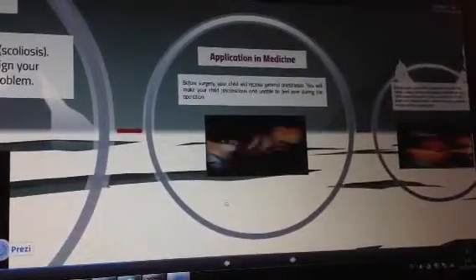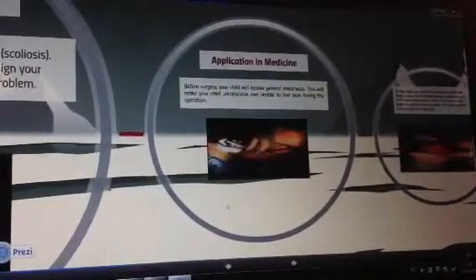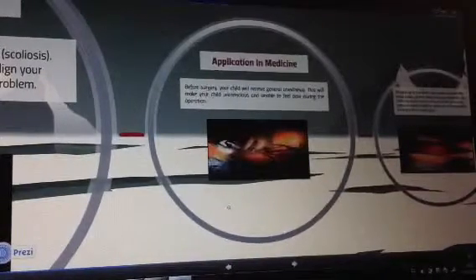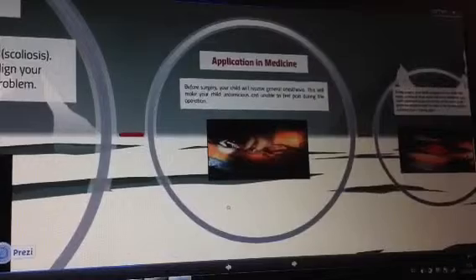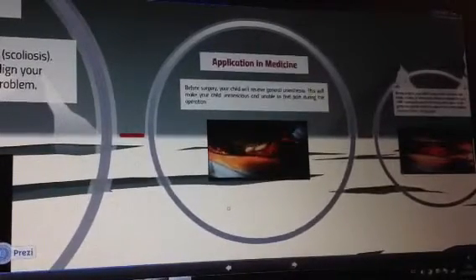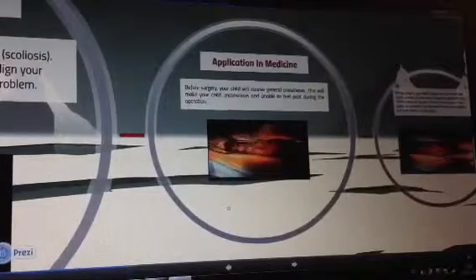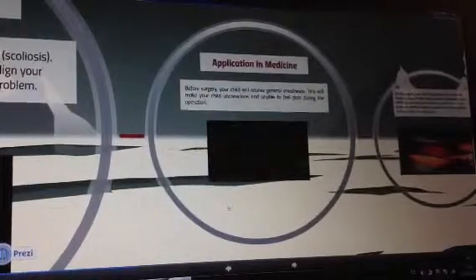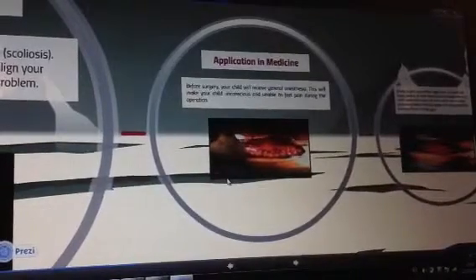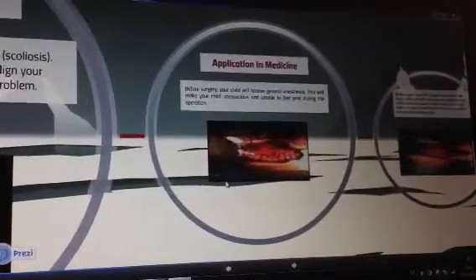Addressing the thoracic curvature, a subperiosteal dissection of the spine is performed, exposing the transverse processes, the facet joints, and the midline ligamentous structures. The interspinous ligaments are removed with a Leksell rongeur, as shown here. And then at each segment, facetectomies are performed, which have already been done.